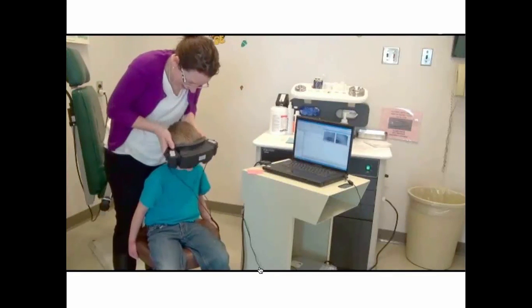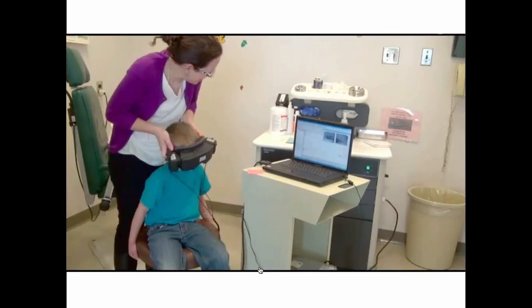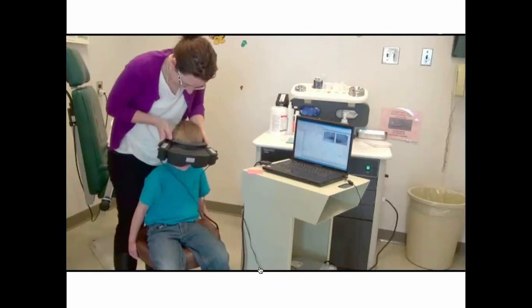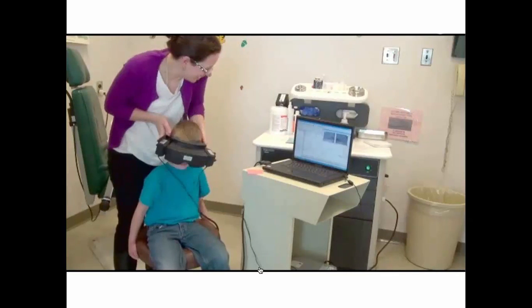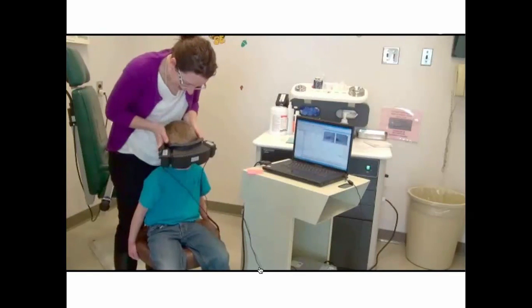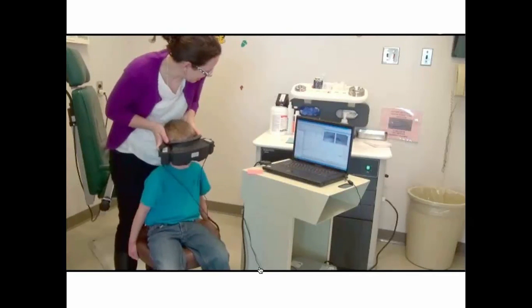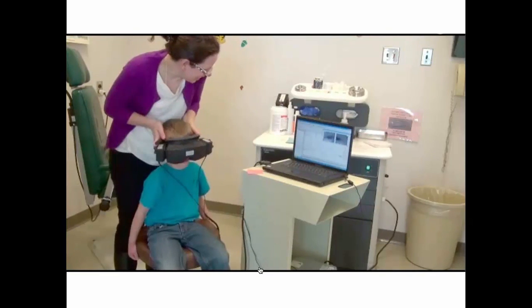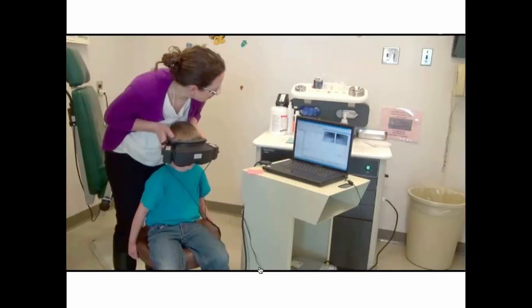I usually try and make this a little bit of a game, so we either sing a song or we practice saying no, that we're not going to clean our rooms, no, no, no, we're not going to eat our vegetables, and the kids really do get into it. We want to charge those labyrinths for a period of time, and then what we're going to do is look to see whether or not there's any beats of nystagmus once we have finished the head shake testing. Again, you can do this qualitatively or quantitatively depending on the system you have and the tools that you have in the clinic.